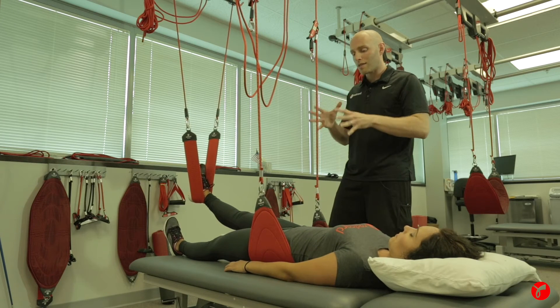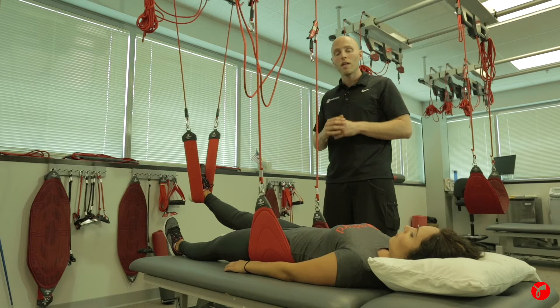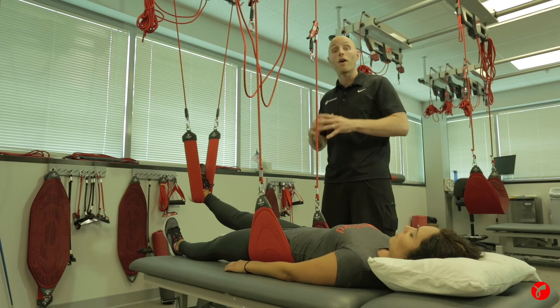This can be utilized in any closed kinetic chain position using the Red Cord. And in just a minute, we're also going to show you how you can use this in a standing position.